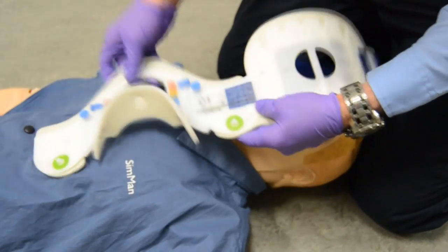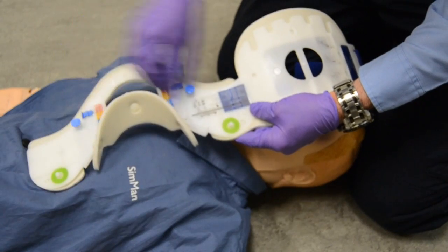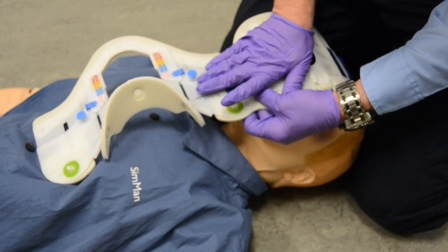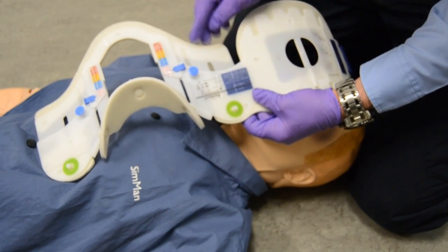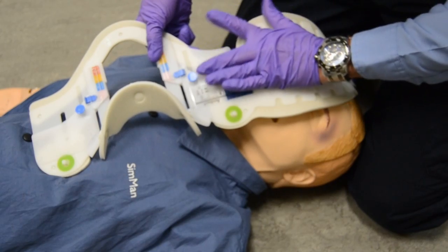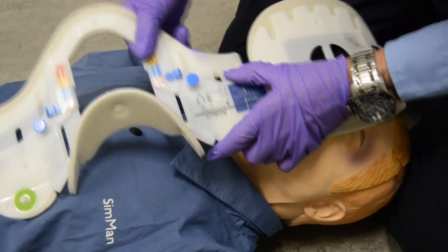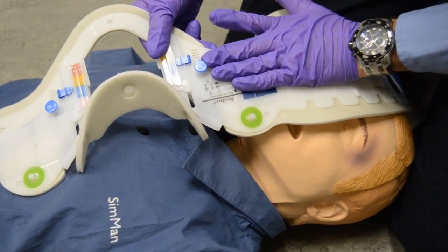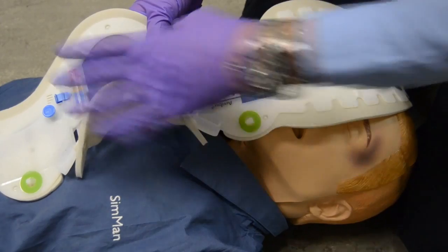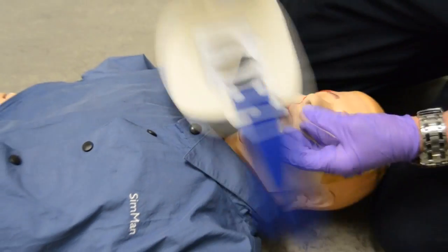Then we take our collar, and if you look on the side it says sizing line. You release all the locks here, make sure you can extend the collar out. You take your three fingers, place them even with this line — this plastic piece, not the foam insert. You go one, two, three. The bottom of this plastic should come all the way up right there. Should be exactly three-finger width depth. Once you have that, you secure it and lock it in place, and then we can place it on our patient.